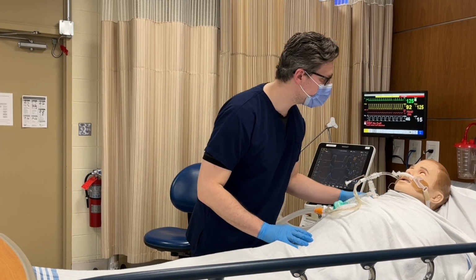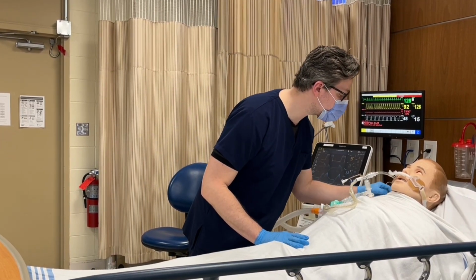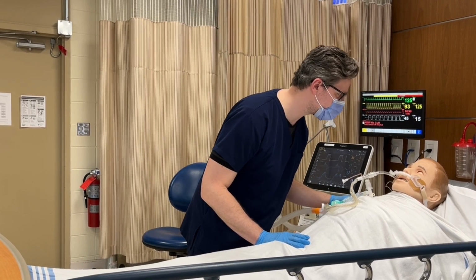Hello, Stephen. My name is Mike McKenzie. I'm a respiratory therapist. I'm going to perform a patient assessment on you right now to see how you're doing on this mechanical ventilator.